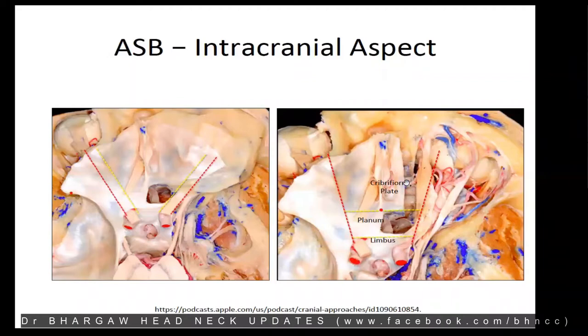You see that's the roof that is removed, and you see the ethmoidal arteries and all coming in the nasal cavity. So just keep in mind this yellow line here that is drawn from the medial border of the orbit posteriorly going towards the optic canal on either side. So that's the area which tells you that these structures will be amenable for your endoscopic resection. Keep this in mind as we would further discuss as to what are the indications and contraindications.